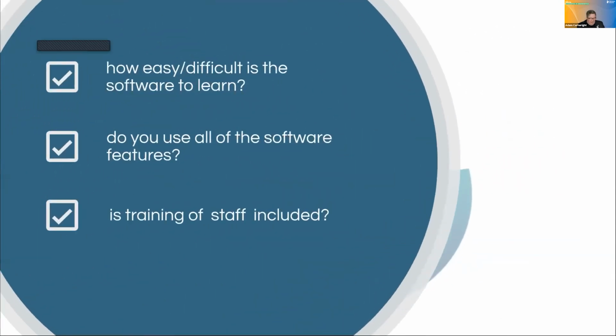Think about the software integration. Is the software nice and easy to use? Is it intuitive, guiding you through step by step? Or is it something quite difficult that is going to take a lot of time to get everybody up to speed? And what are the features? Are there features there that you want to use?